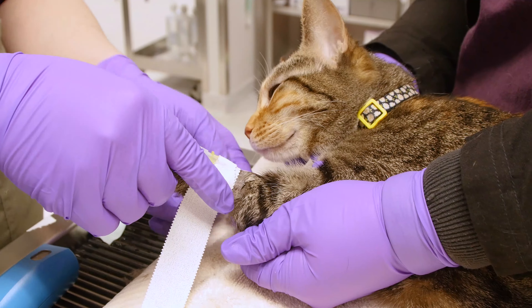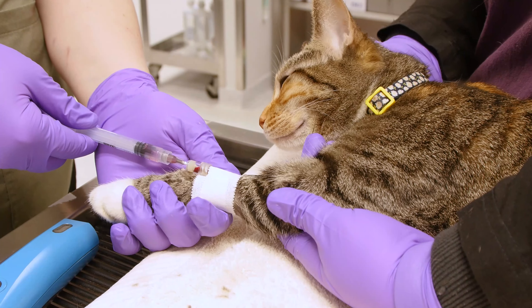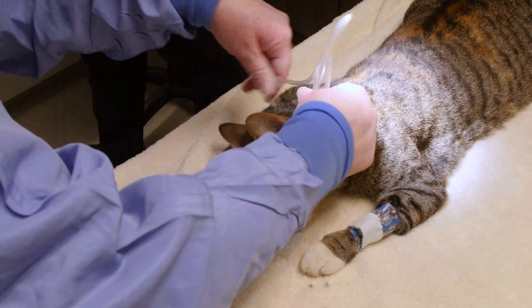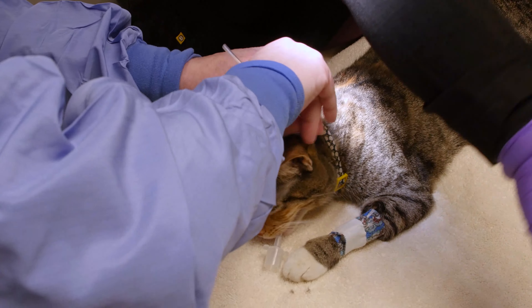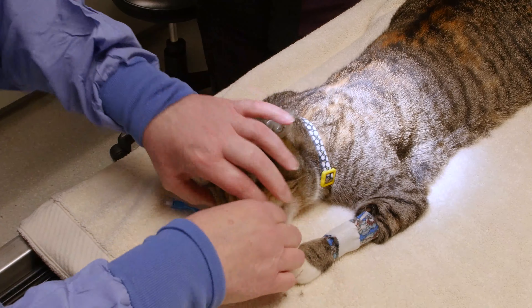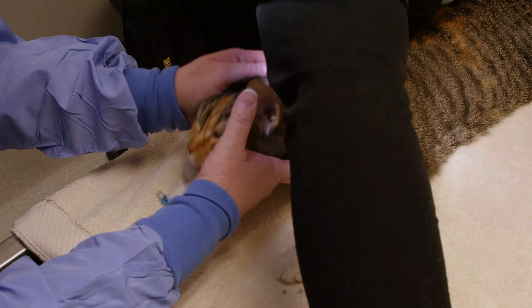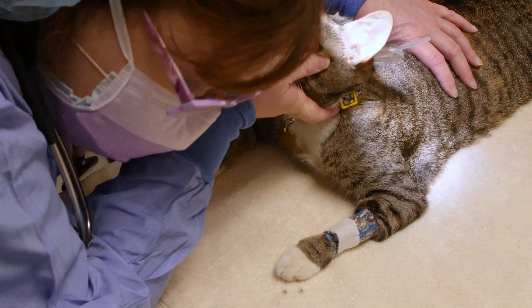After the IV catheter is placed, the patient will receive an induction. Once the induction is given, the patient will be ready for intubation. An endotracheal tube will be placed that allows us to deliver oxygen as well as a gas anesthetic through their trachea and into their lungs, which helps maintain general anesthesia.